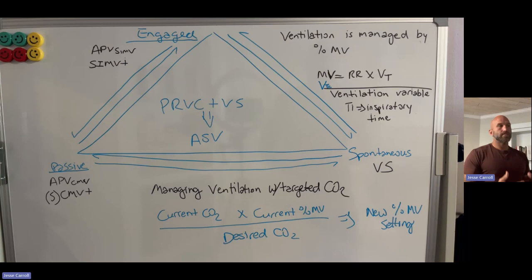Most of my rescuers and my medics that are out there are not familiar with the nuances between volume controlled and pressure controlled breaths. This can become extremely problematic even on those shorter transport times, which we all know there's no true 4-minute transport because we have to include scene time and delivery time of acceptance into the facility. So usually what I like to ask is, what is your average contact time that you're spending with these patients, right?